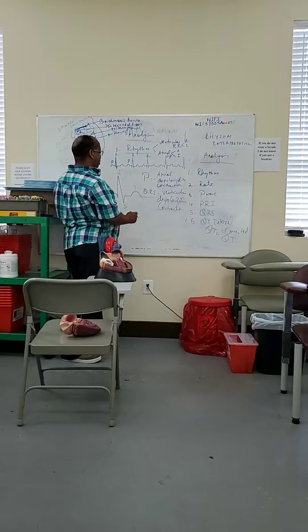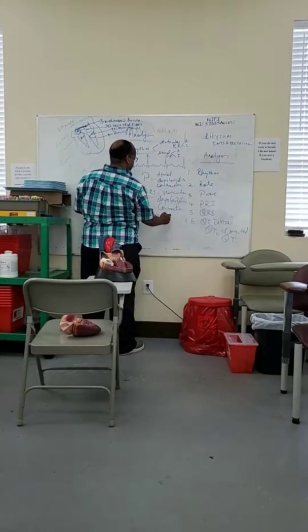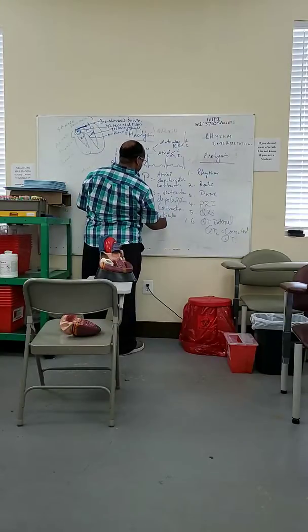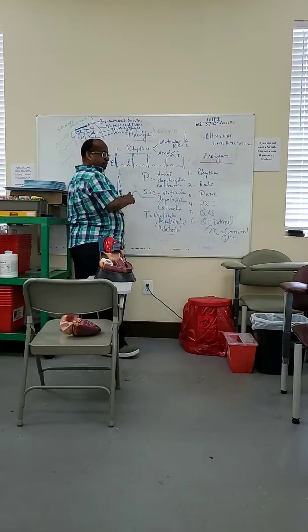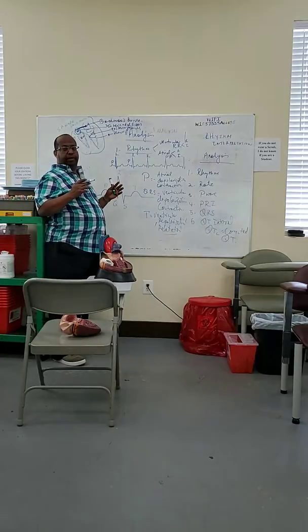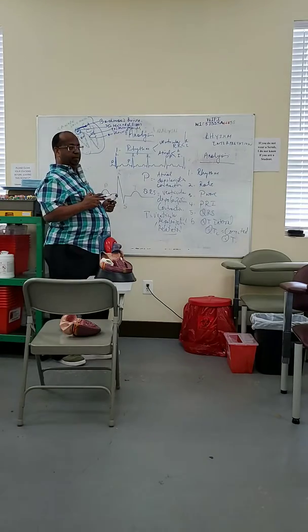Rather than depolarization, it will be ventricular repolarization, which means relaxation. That means the ventricles relax. Okay, that is called repolarization. So that is what this depicts, PQRST.